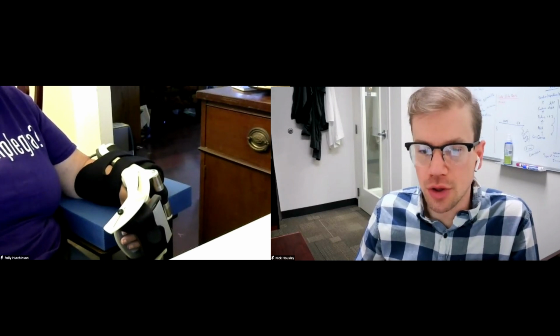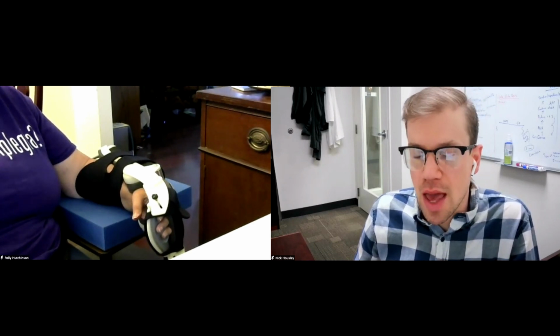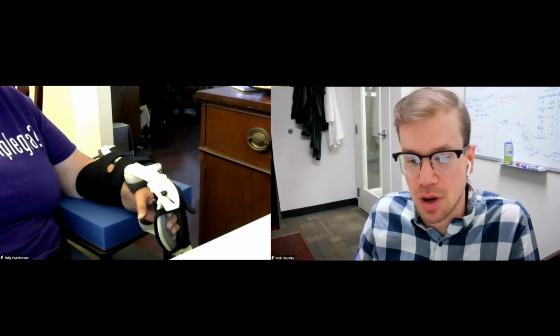Oh, yeah, good. So I'd say first things first is make sure you have it taken off, so off of your left arm there. And the best thing to do is there's just a power button on the front. You can just press that. And that will turn the system off, the screen off.